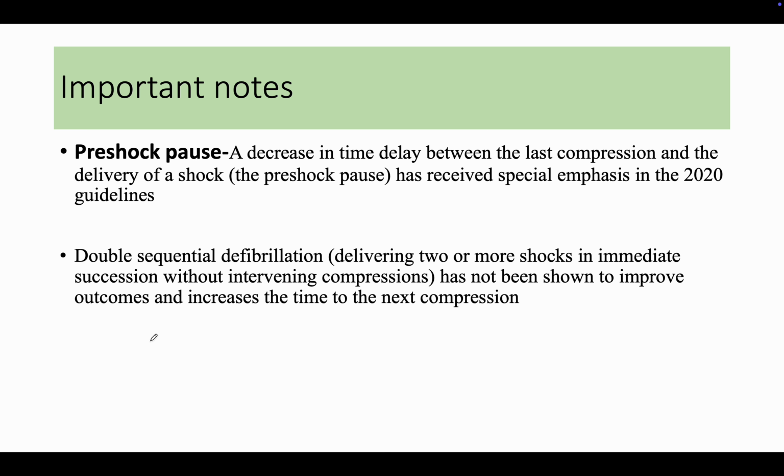So what will happen if the patient is in VF, you give the shock, and you assess that the patient is still in VF? Will you do CPR or give another shock, because it's a shockable rhythm? Previously, they gave another shock right after the shock, which is called double sequential defibrillation. But it has not been shown to improve outcomes and it increases the time to the next compression. So nowadays it is recommended that if the patient is in VF, you give the shock first and then start the compressions. This is recommended in the 2020 guidelines.